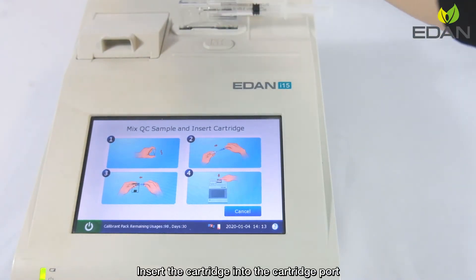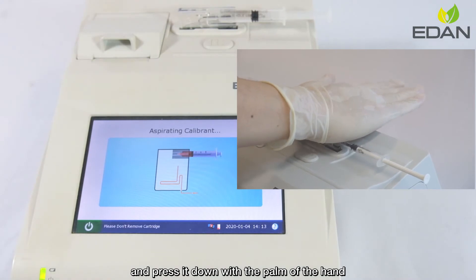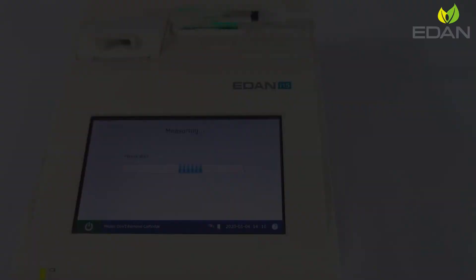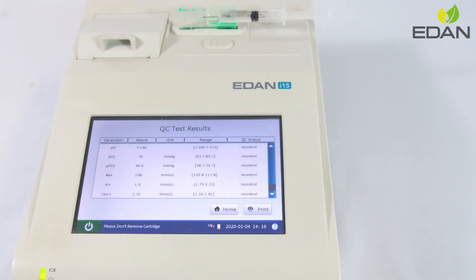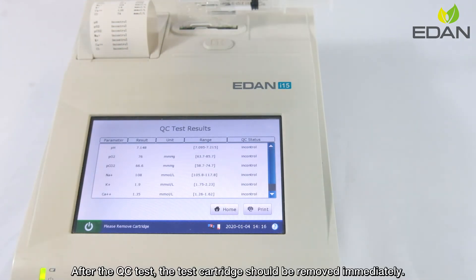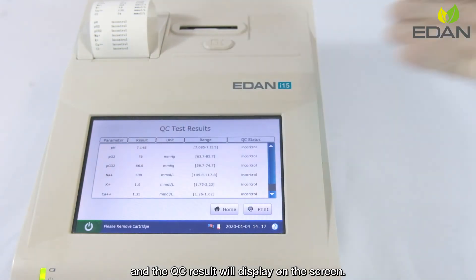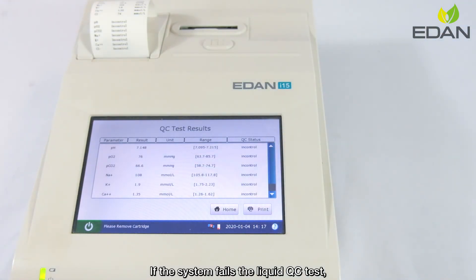Insert the cartridge into the cartridge port and press it down with the palm of the hand to ensure that it clicks into place. After the QC test, the test cartridge should be removed immediately and the QC result will display on the screen. If the system fails the liquid QC test, contact Eden or its authorized distributors for assistance.